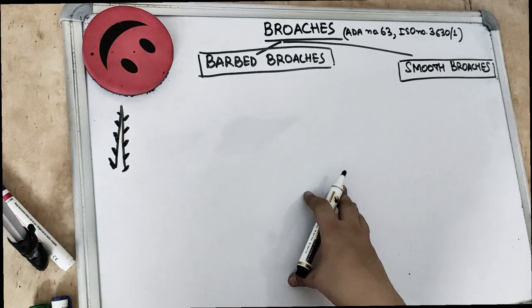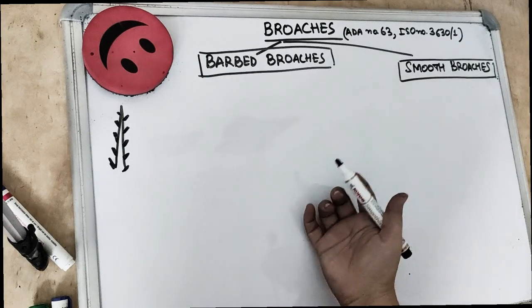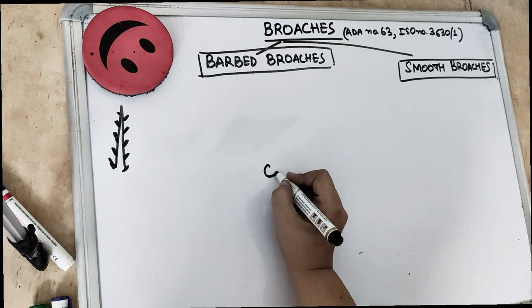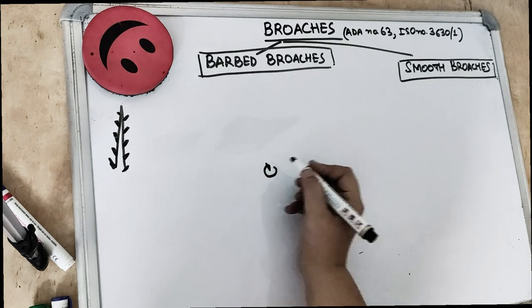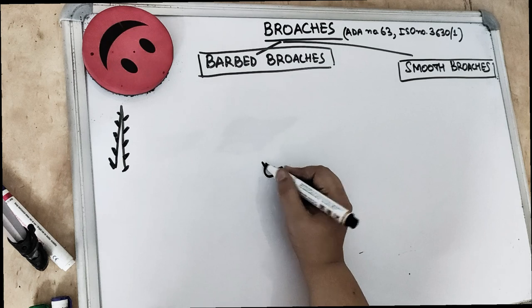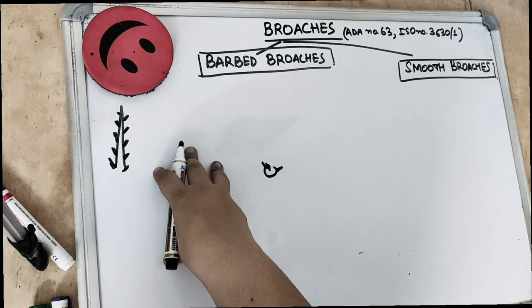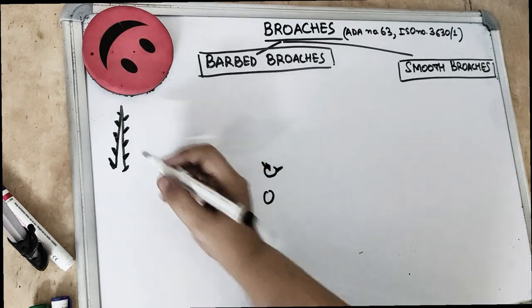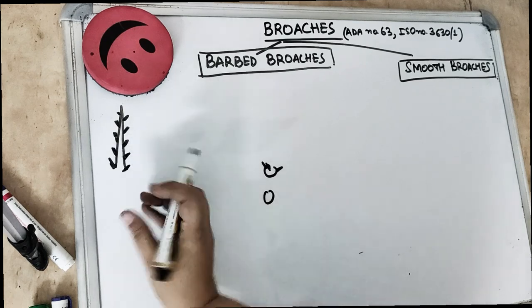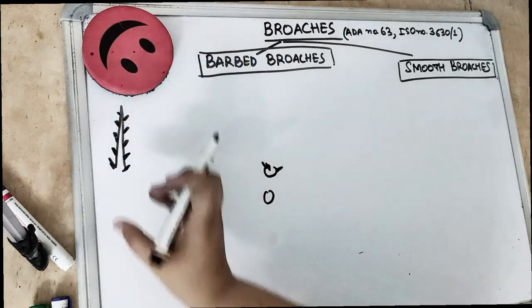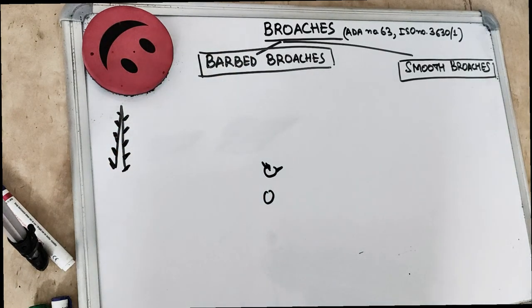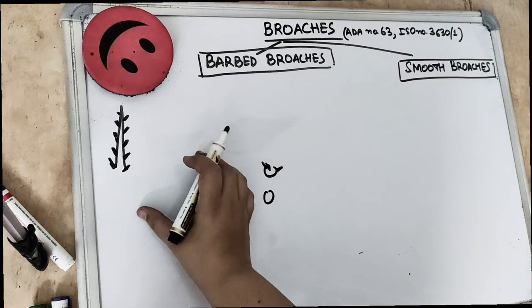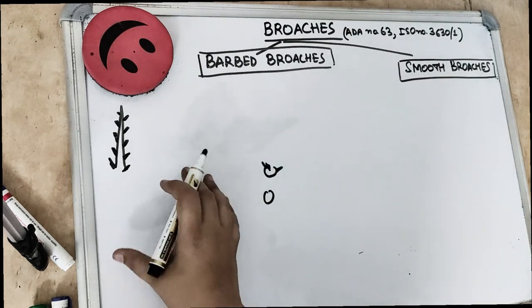Broaches are the instruments which are made up of stainless steel wire, a round stainless steel wire with some blades to form the sharp projecting barbs. So if we talk about the barbed broaches, they have sharp projections. Can you see the sharp projections? On the stainless steel file, they have the projections which are used for cutting or snagging the tissue.